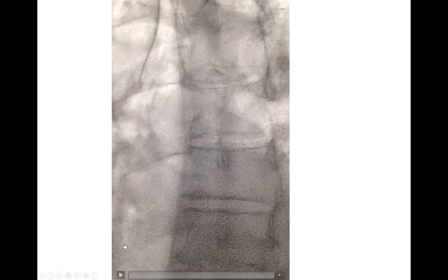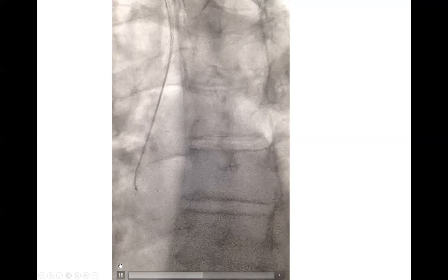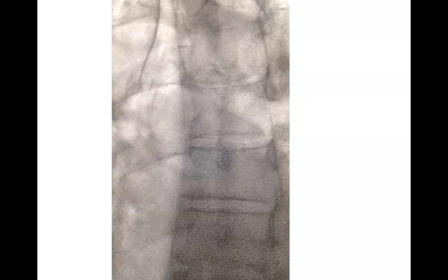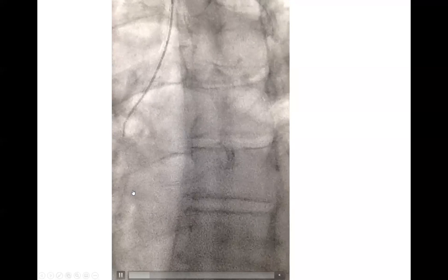Another illustration of how to engage from below. That technique works better with diagnostic catheters, but it works even better with some guiding catheters like the Ikari Left. This is specifically an Ikari Left guiding catheter.